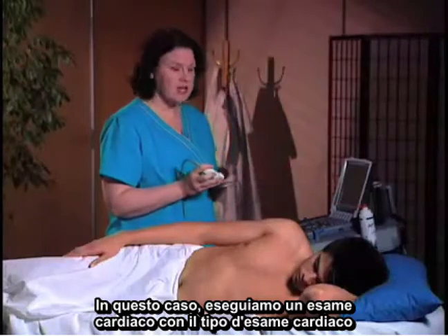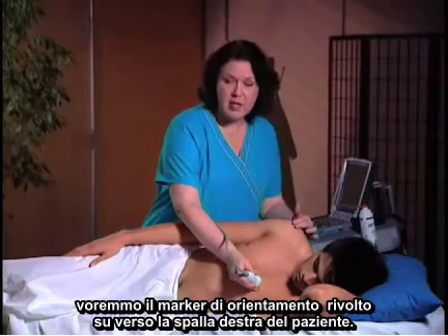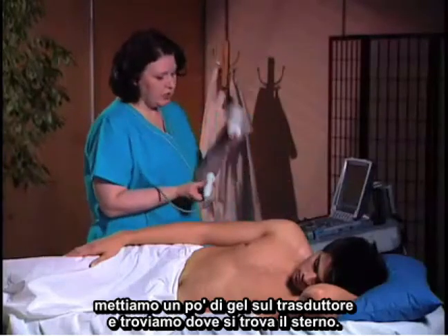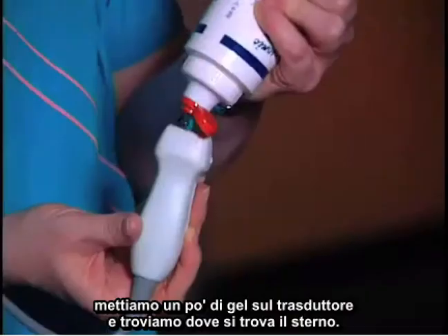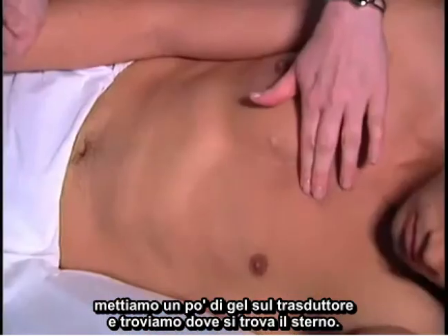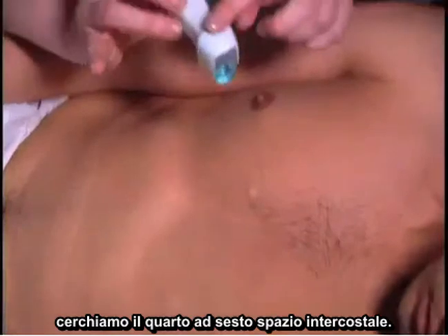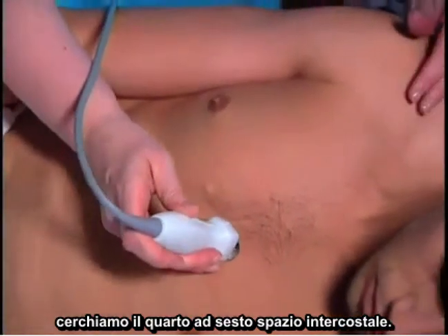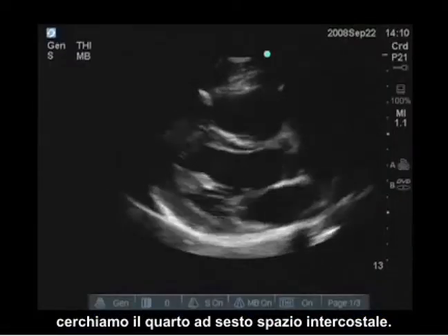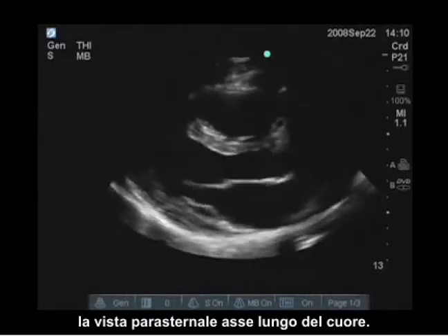When doing a cardiac examination with a cardiac exam type, we want the orientation marker facing up toward the patient's right shoulder. Once we have the orientation figured out, we put a little bit of gel on the transducer and find the sternum, then move just a little bit to the left, looking for the 4th to 6th intercostal space. That should put you in the ballpark area for the parasternal long axis view.